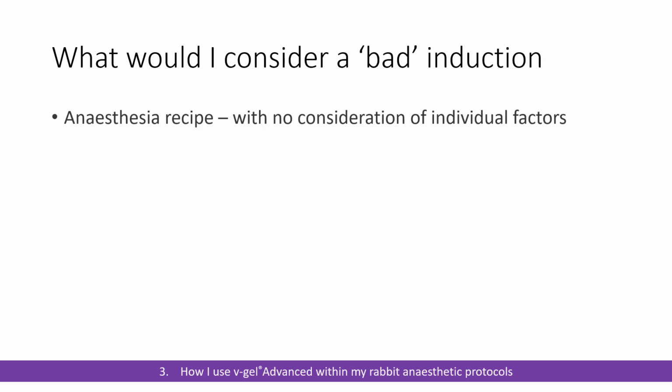Bad induction for me, anaesthesia recipe. It's a rabbit, it gets this. You're going to miss a great deal there. You're going to end up giving patients unnecessary drugs, or you're going to end up not giving patients drugs that they actually need. And particularly, something people tend to forget will be adequate analgesia for the procedure that you're undertaking.